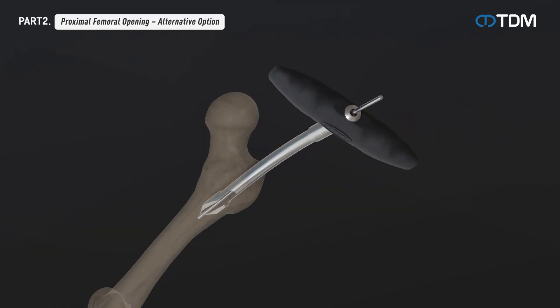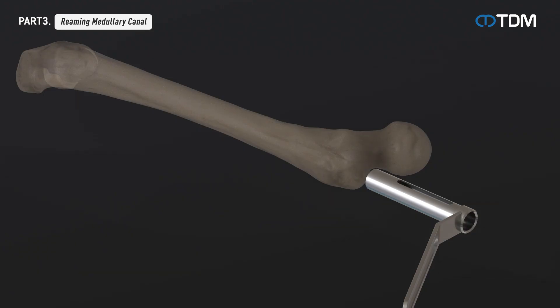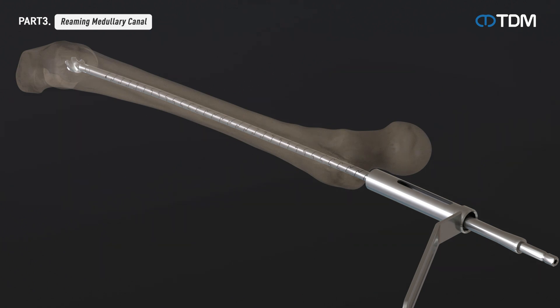Alternatively, opening the medullary canal may be performed using a primary awl. Insert the reaming rod with the ball tip to the desired depth. Using a flexible reamer shaft, reaming is carried out along the reaming rod to the desired size, starting with an 8.0 millimeter reamer head and increasing by 0.5 millimeters. The reaming is 1.5 millimeters larger than the diameter of the nail to be used. The reaming rod with the ball tip is not removed even after reaming is completed.